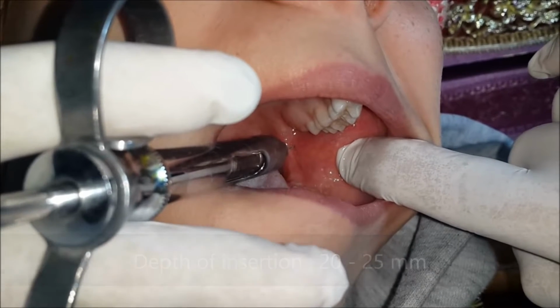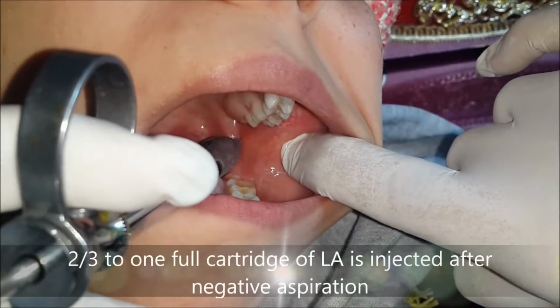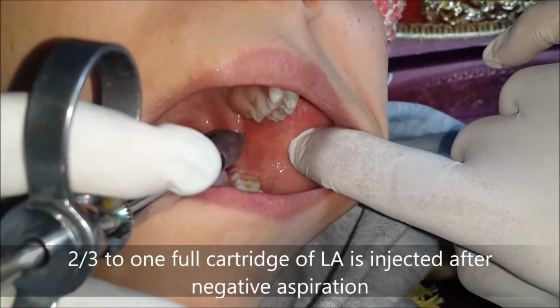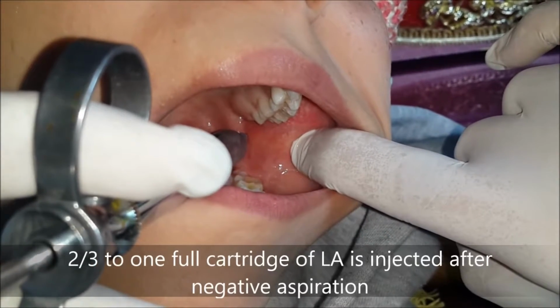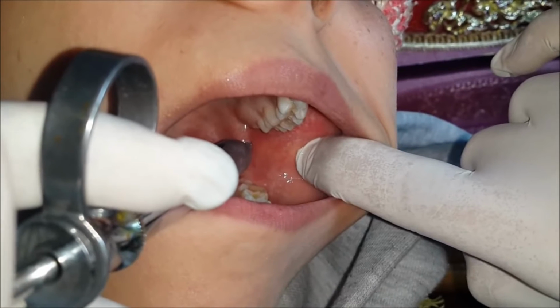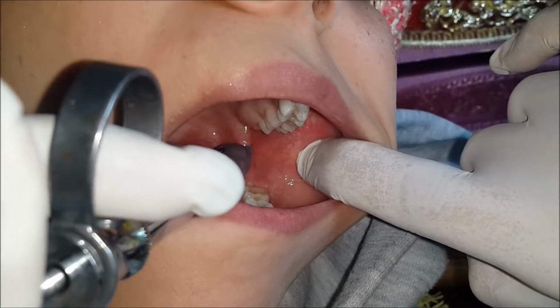Once bone is contacted, the needle is withdrawn slightly. Then injection of 2/3 to 1 cartridge of local anesthetic is performed after negative aspiration. Then the needle is withdrawn.